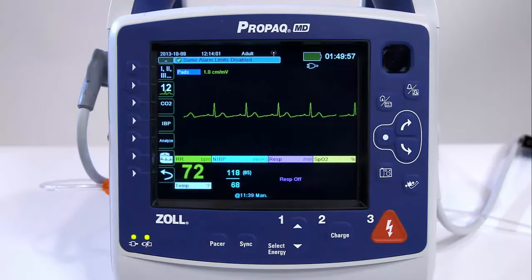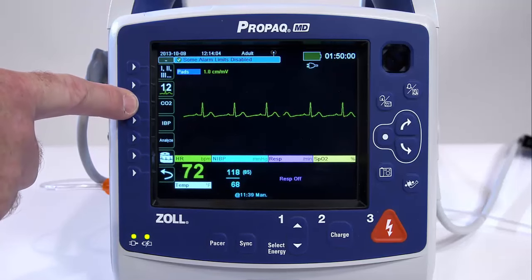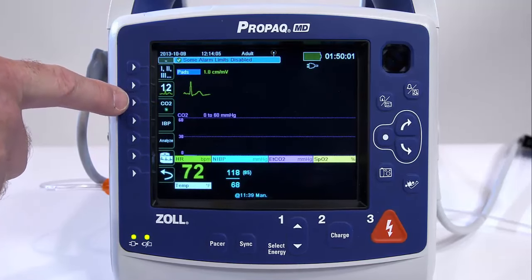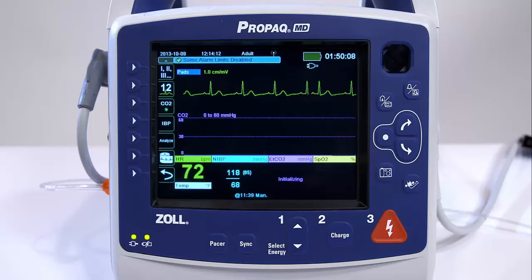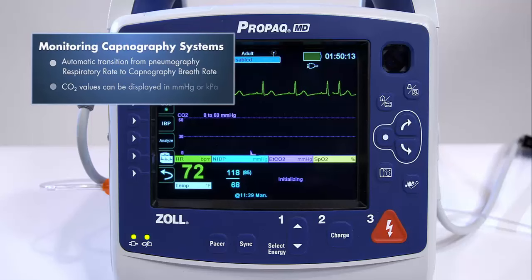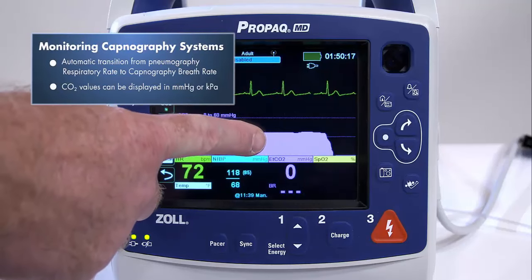Press the CO2 key to activate or deactivate capnography. As soon as capnography is activated, the capnographic waveform automatically appears on the screen. Respirations, which are measured through changes in thoracic impedance, automatically transition from impedance pneumography to capnography measurement.